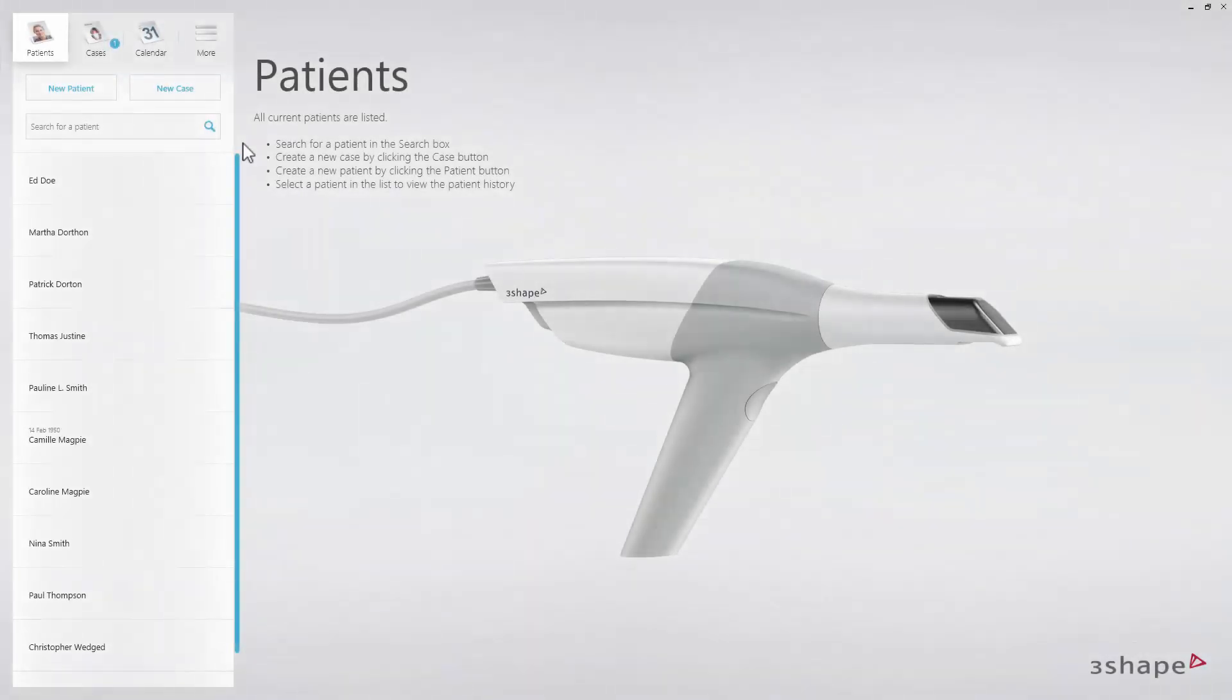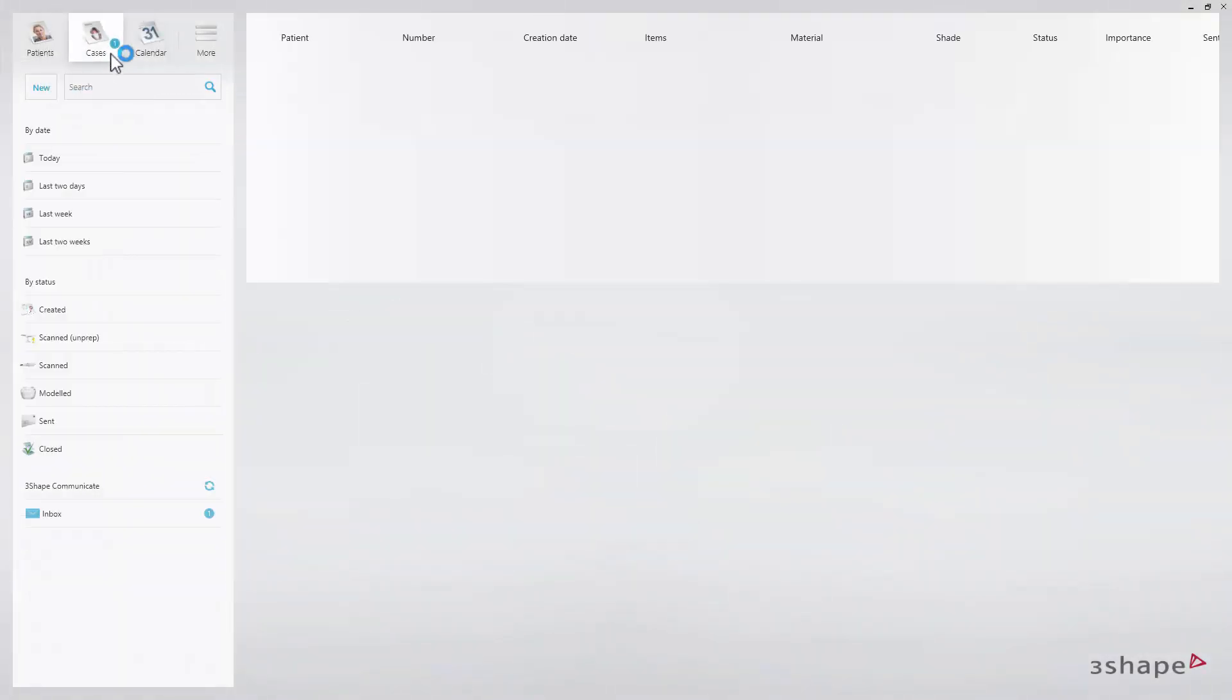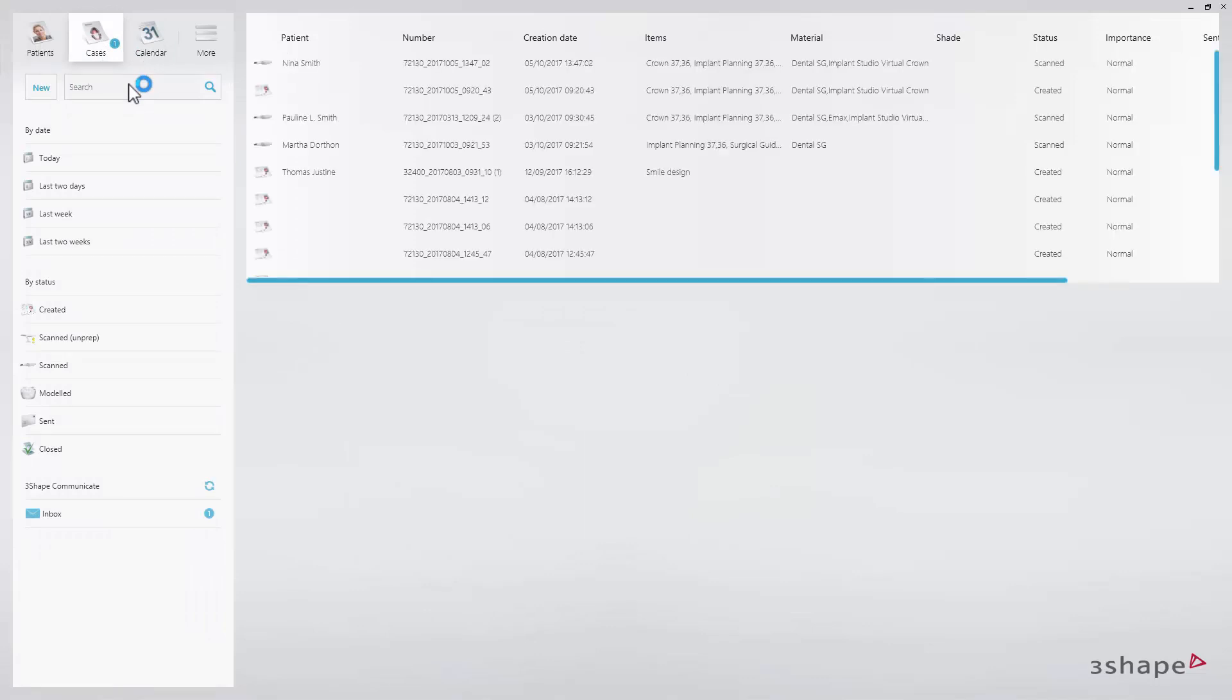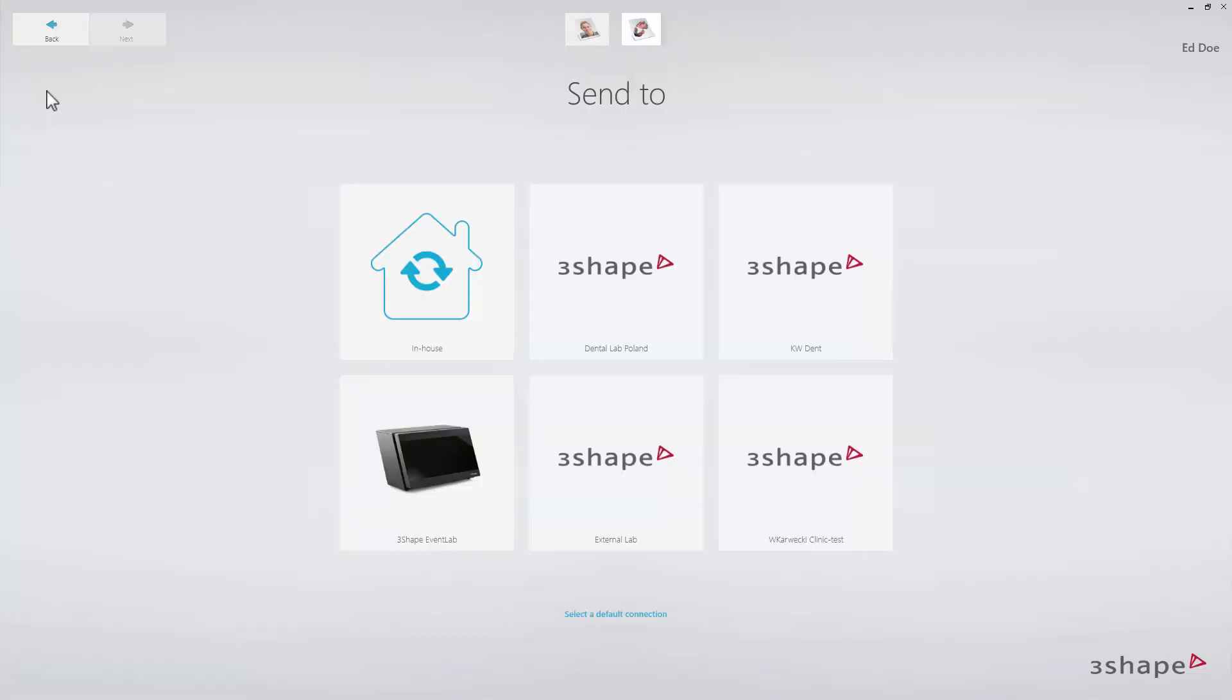You can also create a new case from the case overview. Click on the cases tab and the case manager will appear. To create a new case in the case manager, click the new button and select who to send the case to.